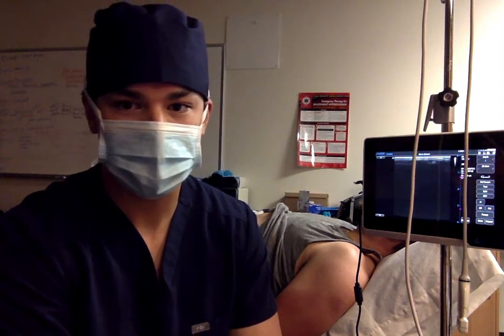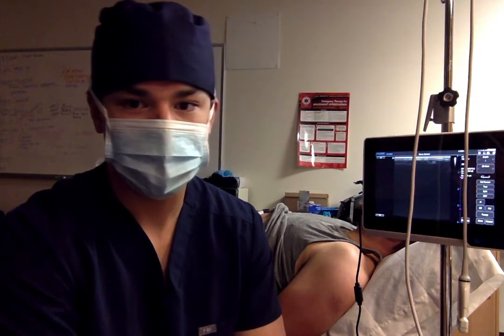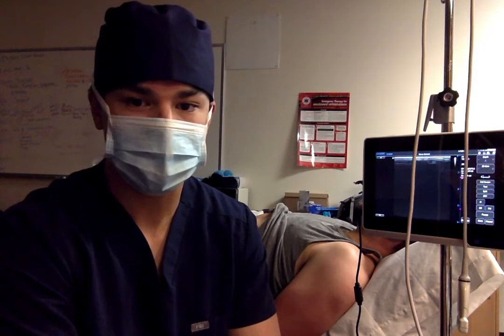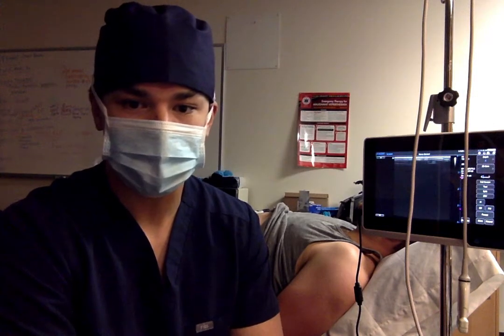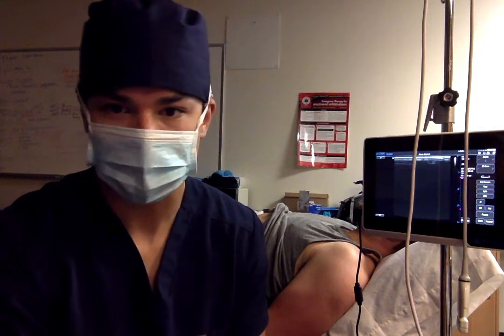Hi, my name's Adam. I'm going to be your anesthesia provider. We're going to be doing a subcostal TAP block. It's a transverse abdominis plane block. This is going to be for pain management during your abdominal implant surgery. You're a 30-year-old male, no other comorbidities.